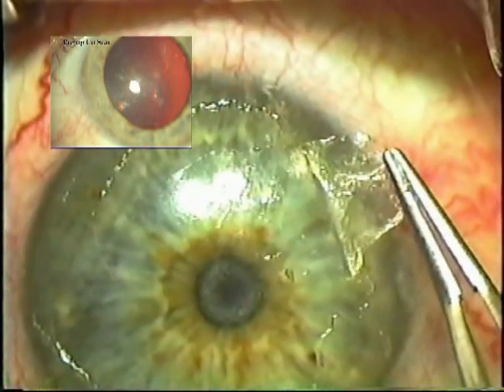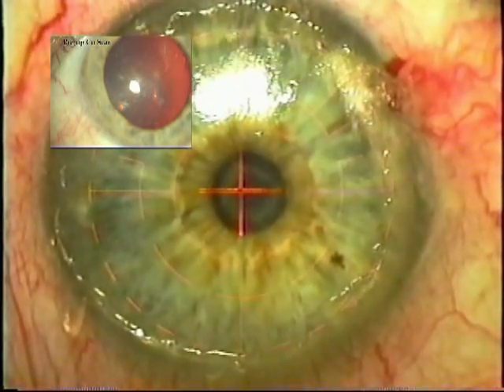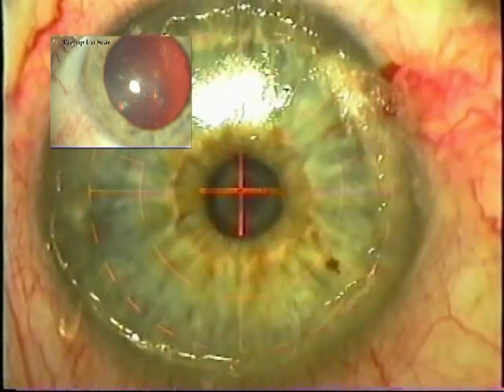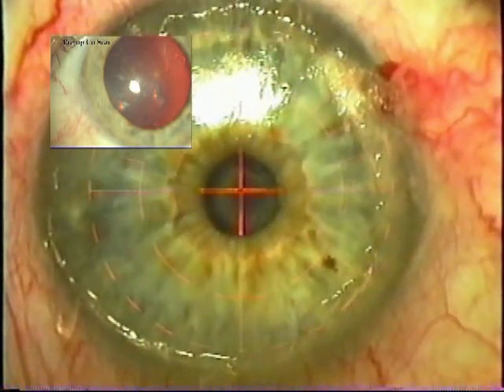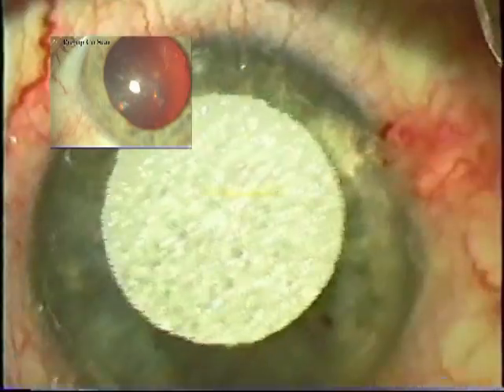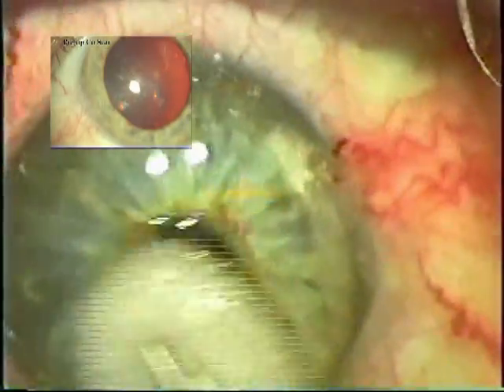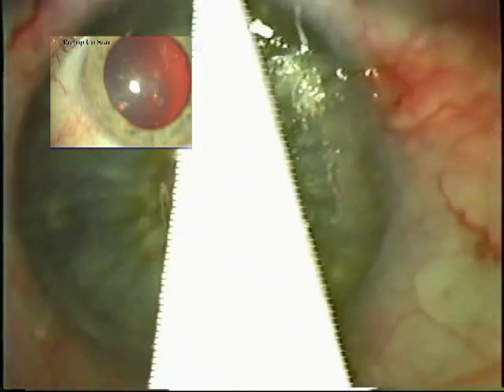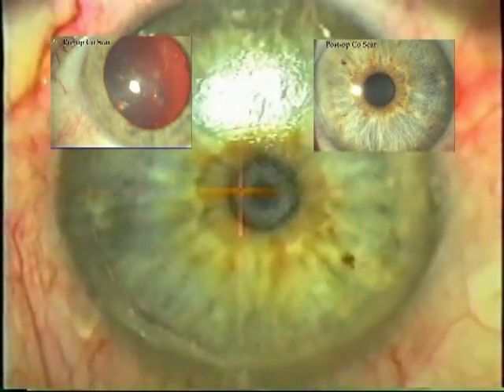Once the scar has cleared the visual axis, the excimer laser photoablation can continue. This is followed by mitomycin C application, once again, to a clear visual axis with an excellent refractive outcome.